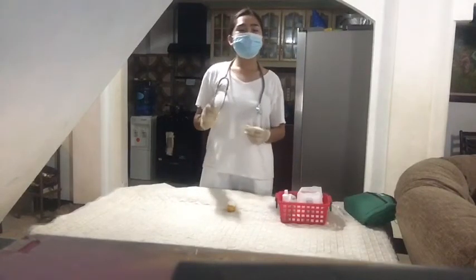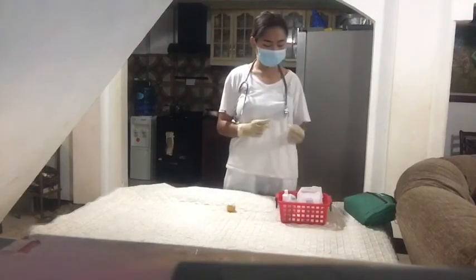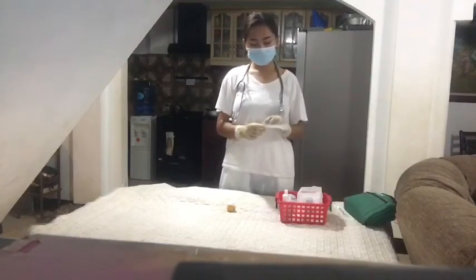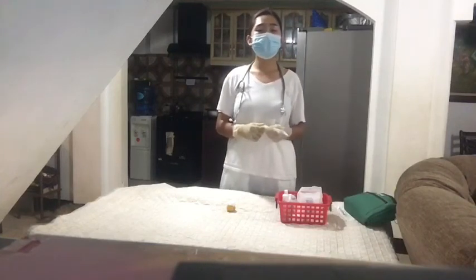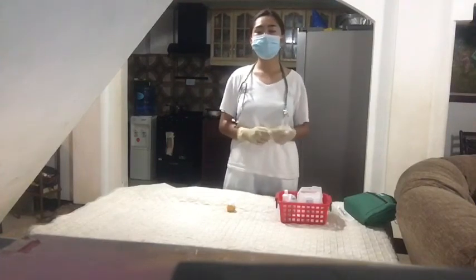Discard the uncapped needle and syringe in a safe receptacle. I will now cover the used syringe and dispose it in a sharps bin. It is because most accidental needle sticks occur while recapping needle. This prevents injury.